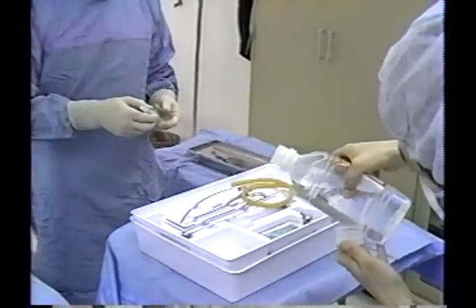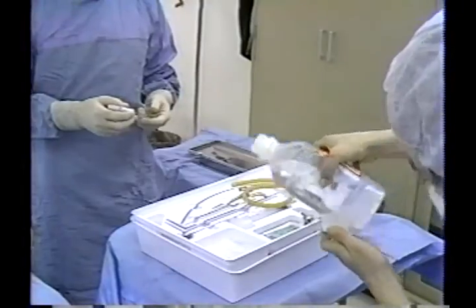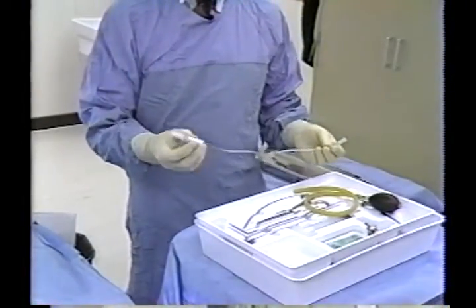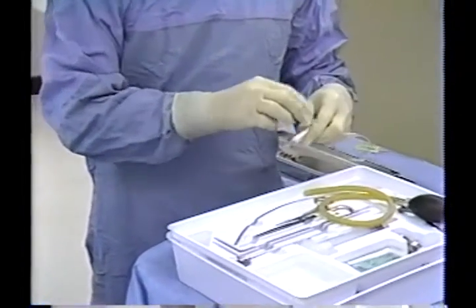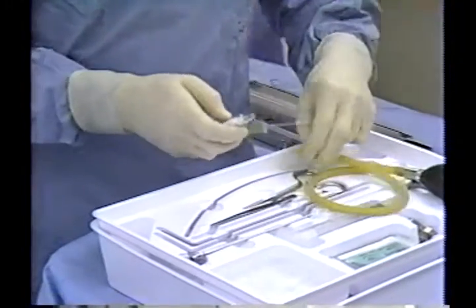The bottom tray is placed on the top position and sterile saline solution is poured into the tray for catheter soaking. Tray number 2 has all the elements needed to complete the catheter implant procedure. The filter for the insufflation device is attached to the tubing of the sphygmomanometer bulb that has been steam sterilized.